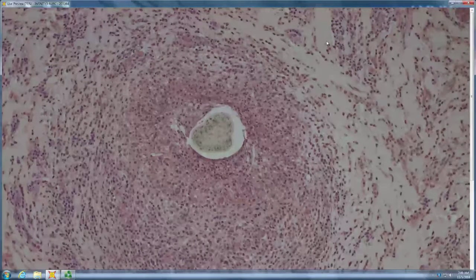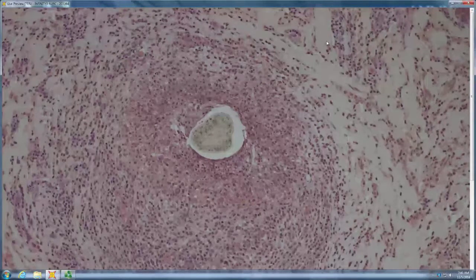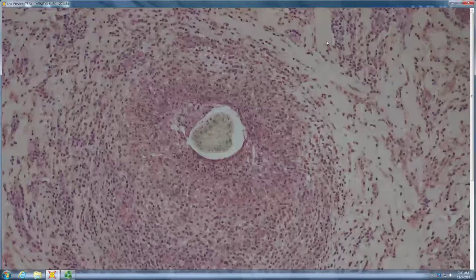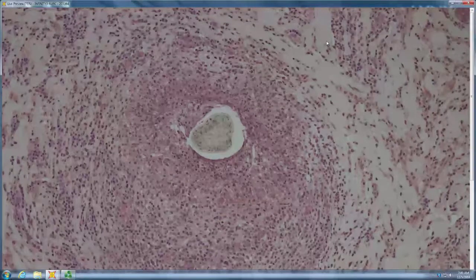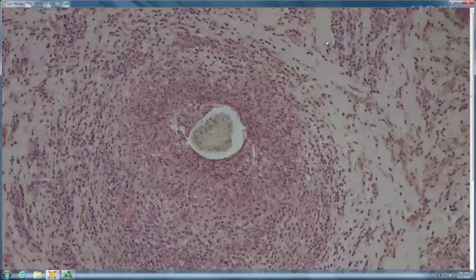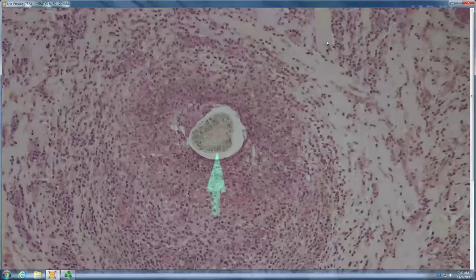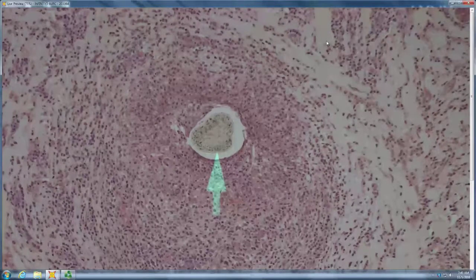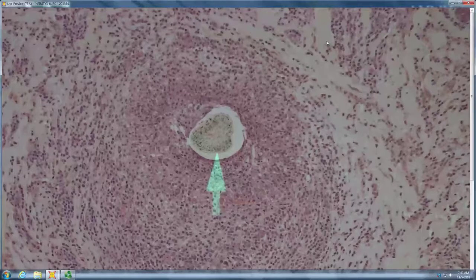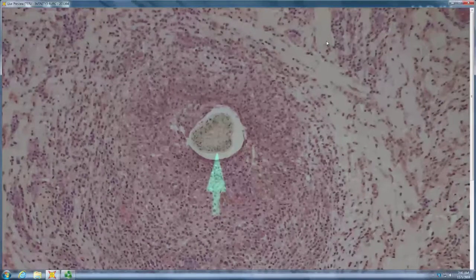Folliculitis decalvans and alopecia areata both love to have EOs in them. Fungal alopecia also likes to have EOs, right? So could this be fungal? I don't see anything in this hair shaft, but I'll certainly look at the others for the possibility of fungal folliculitis. Usually if you have a nice hair shaft there, you'd expect to see the fungus in it. So fungal becomes less likely just because we see the hair shaft, even though that can do suppurative and granulomatous with EOs. Folliculitis decalvans absolutely can.